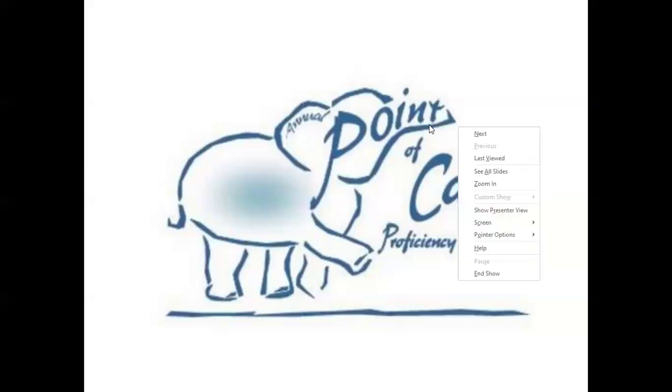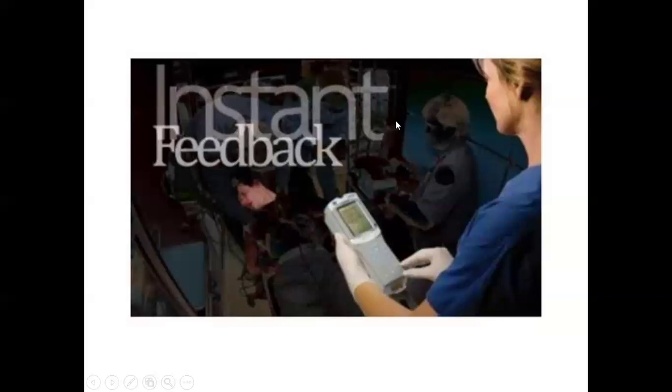Most of us would have seen these point of care devices in our day-to-day life, but we would not have understood the name. What are those point of care? Point of care is nothing but at that particular point, instantly when you put an analyte into a device and you get an answer for it, that is, you get a feedback or an analyte concentration from it, it is called a point of care device. It may be as simple as a pregnancy device where we put a drop of urine and you get the answer whether it is positive or negative.